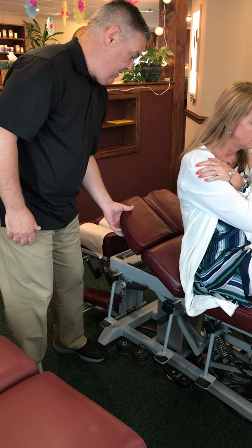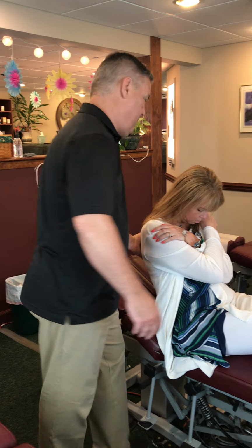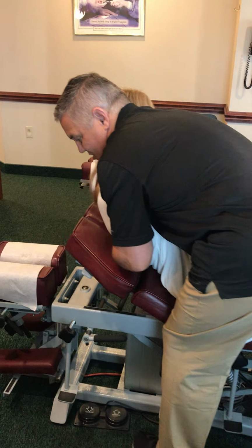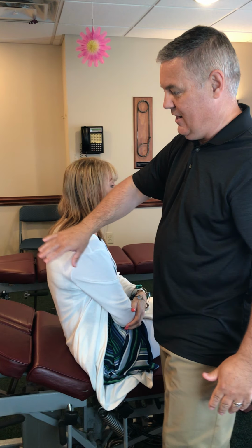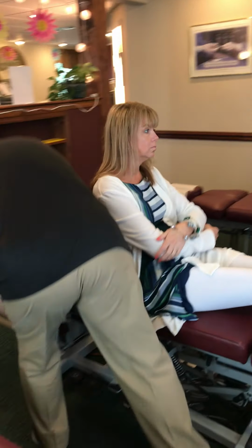We bring the back of the table up. Patient tucks their chin down. We have them take a deep breath in, blow it all the way out, and we're going to gently sit them down with a gentle push. And usually anterior thoracics, I do them because people move a little better that way as compared to a straight anterior, which are laying flat, and or a P to A thoracic. Cheryl, let's have you lay back down.